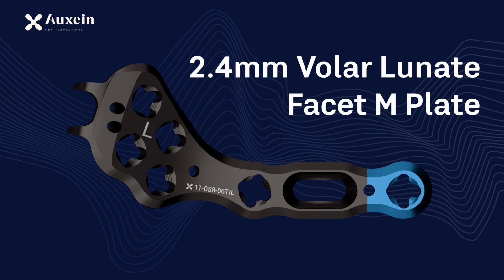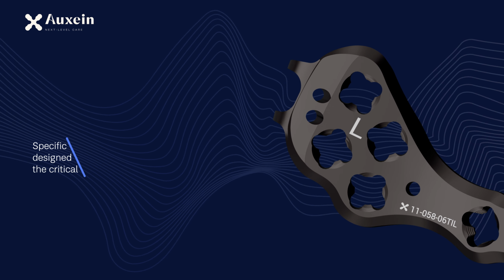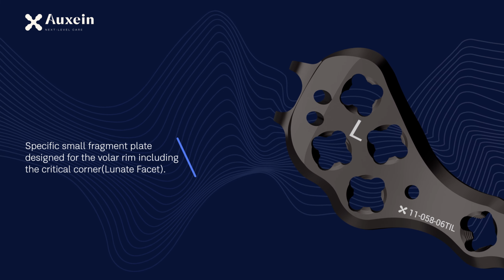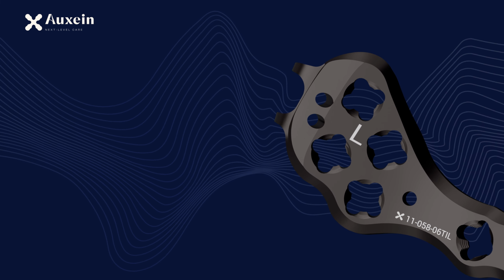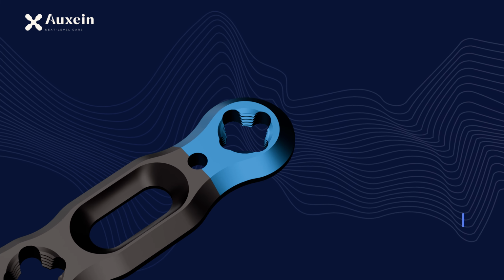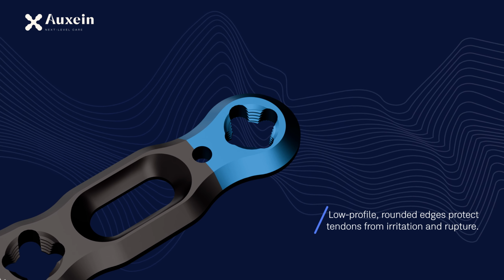2.4mm Volar Lunate Facet M plate. Specific small fragment plate designed for the volar rim including the critical corner, lunate facet. Low profile, rounded edges protect tendons from irritation and rupture.